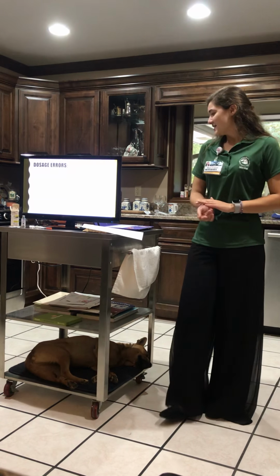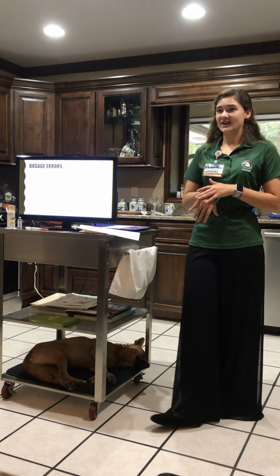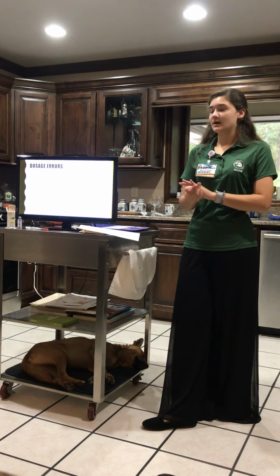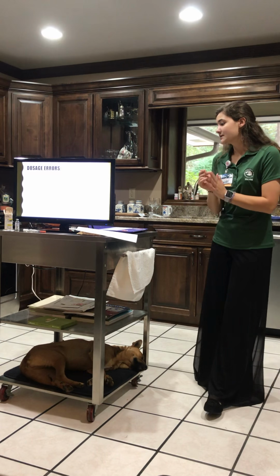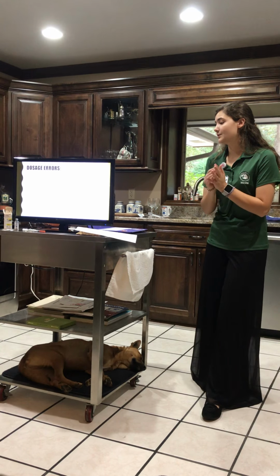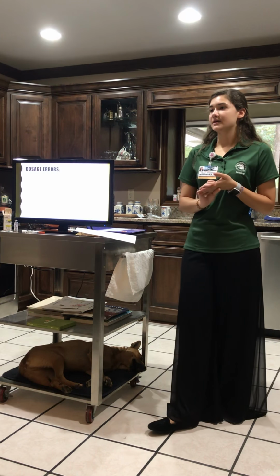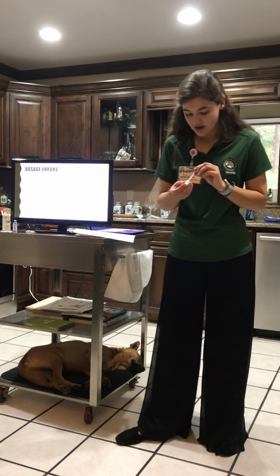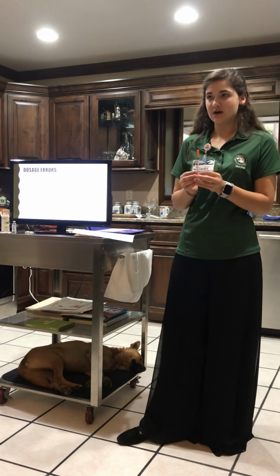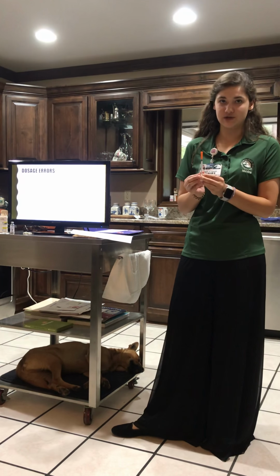And so we also need to pay careful attention to abbreviations, and sometimes, as I have on there, we will mismatch our syringe to our vial, and it's important because each syringe has on there what kind of syringe it is, whether it's a 100 unit or whether it's a 40 unit.